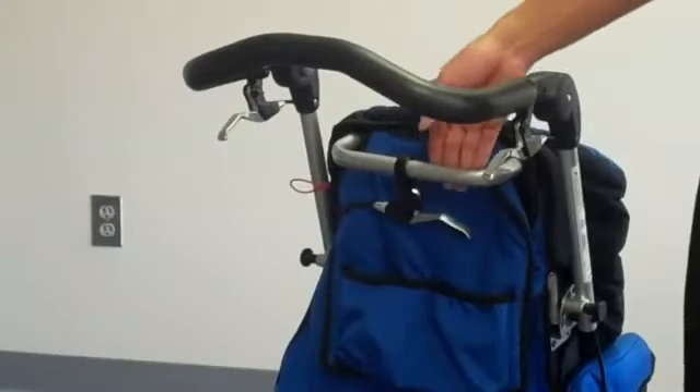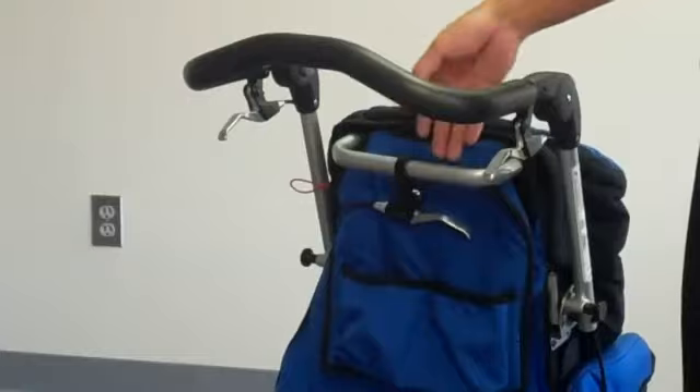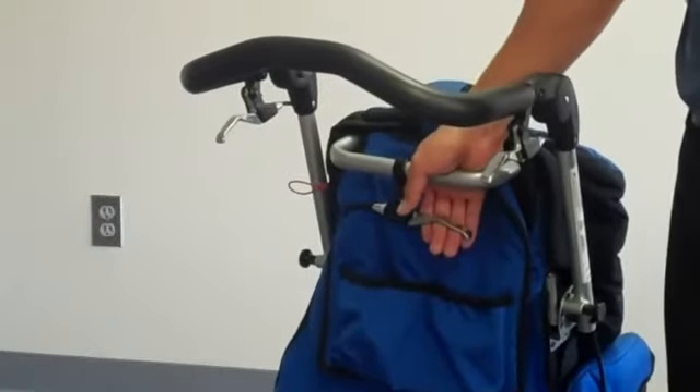Your high-low lever is located at the rear of the CuddleBug at the top of your seat back.